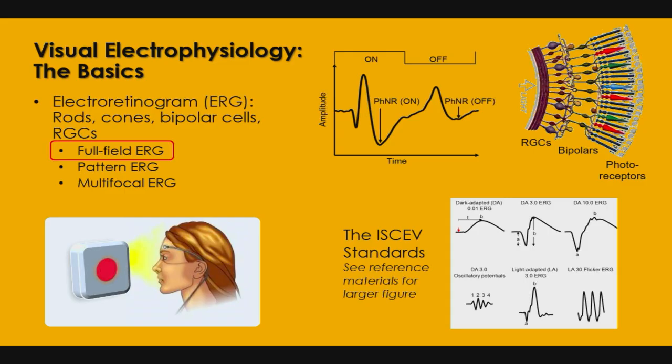Now we can also make the light stay on a little bit longer. And when it stays on a little bit longer, the eye does something called the on and off switching. I think somebody talked about on and off. Yes, good, inside the eye. The system comes on and then goes off, and the signal that is generated by the off pathway will be seen, and you can measure that as well.